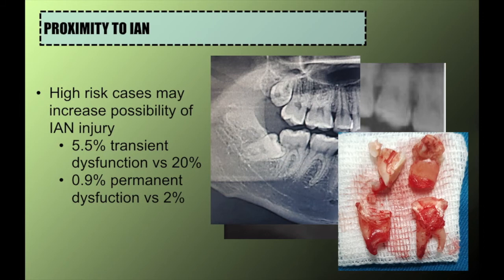An insight on a personal case. Take a look at the shadow on the mesial root superimposing the IAC, inferior alveolar canal. And then you see a more radiodense mesial root as it goes above towards the crown, directly above the IAC. And then take a look. It appears that it has a shorter distal root, and it also shows that it may have a lost white line of the IAC together with a darker root tip on the distal root.